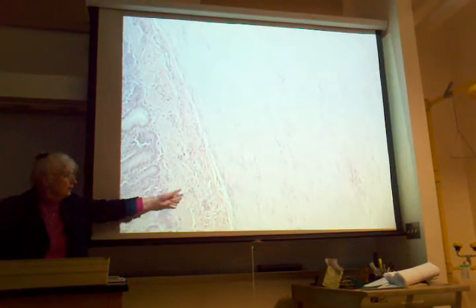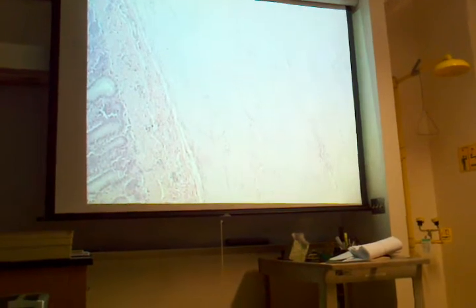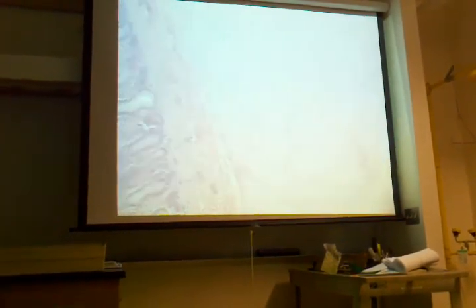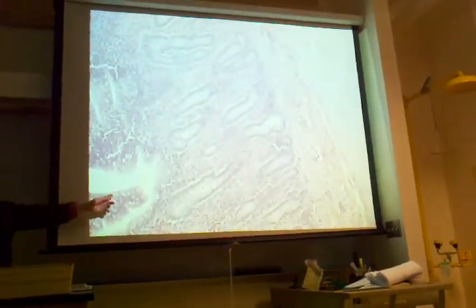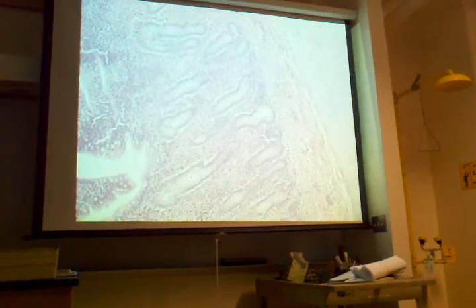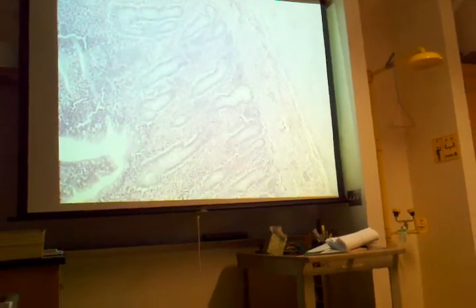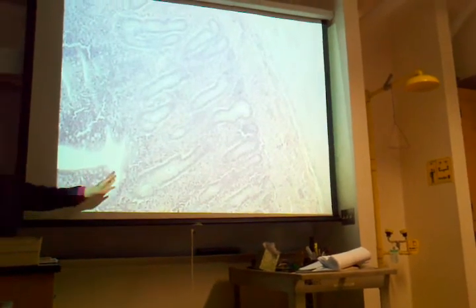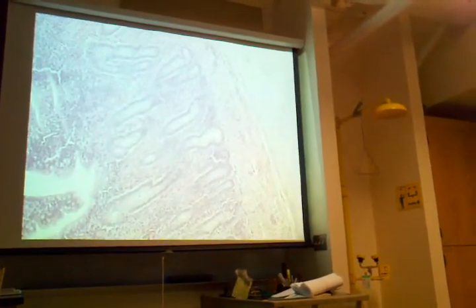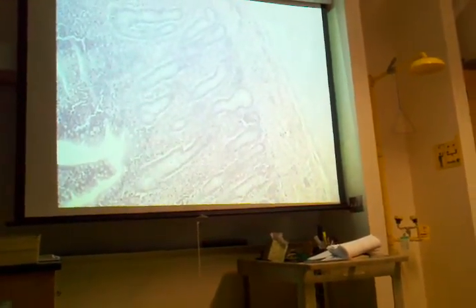Now, let's go in a little further. This is submucosal. All right? Right here is submucosal. It's not mucosal. This is mucosal. Why do you know it's mucosal? One, it stains differently, but the other thing is, if you look closely here, you're going to see lots and lots of goblet cells. Because why? Because even though this is chyme, and soupy, you still have got to protect these layers. And you do that using mucus. So you're getting a lot of mucus in here.